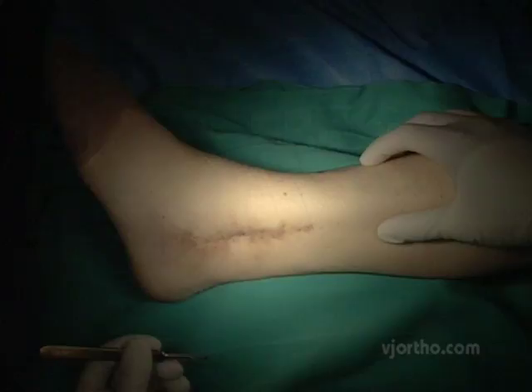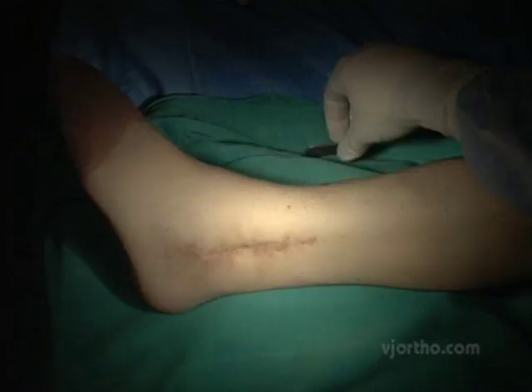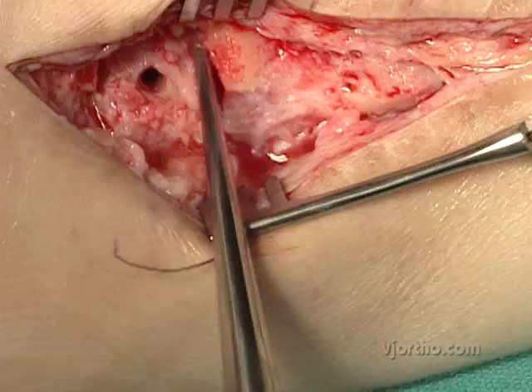This patient has undergone previous ankle and hindfoot arthrodesis but went on to non-union. First I need to remove the internal fixation, which is a rod. He's had a prior lateral approach, which you can see here. I'm going to work into this joint — you can see this is the ankle joint right here, right above this screw hole from the interlocking screw in the talus.